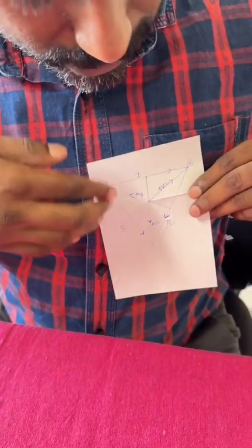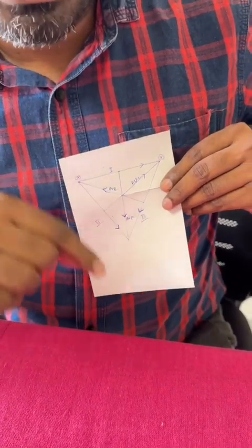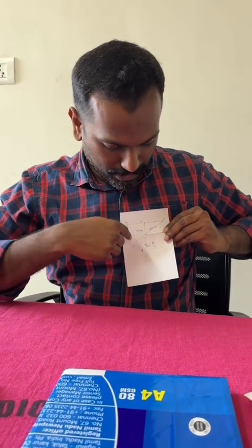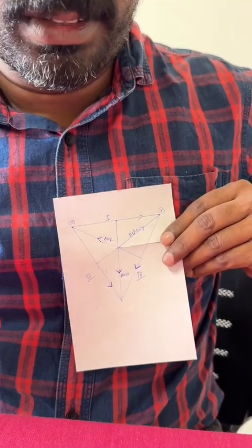Okay, and when we look at the orientation of the heart in this direction, which all leads are pointing to this? Lead 2 and AVF. So if you are seeing the largest positive deflection, that's the biggest R wave, in 2 and AVF, it will be the normal axis. The heart is lying in this direction only.